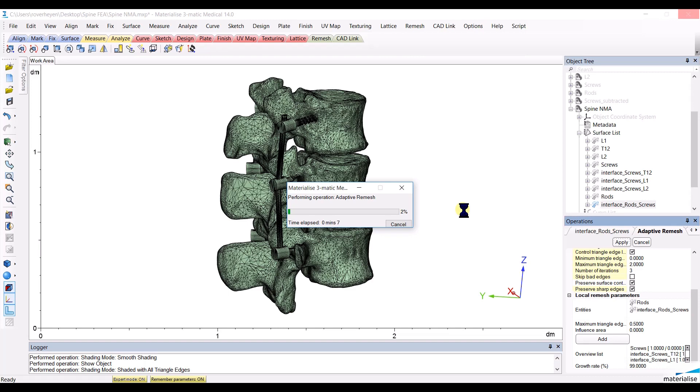A mesh that will be of 2 mm on the vertebrae, 1 mm on the surface of the screws and the interface between the screws and the vertebrae, and a finer mesh of 0.5 mm on the surface of the rods and the interface of the rods with the screws.